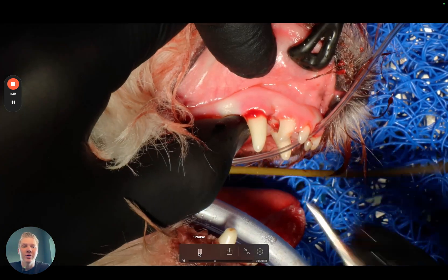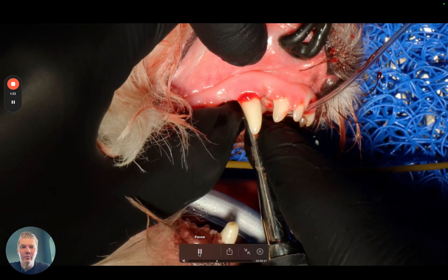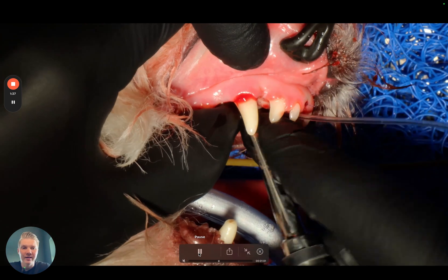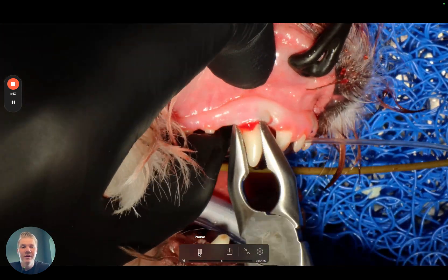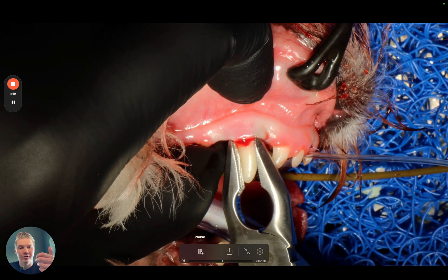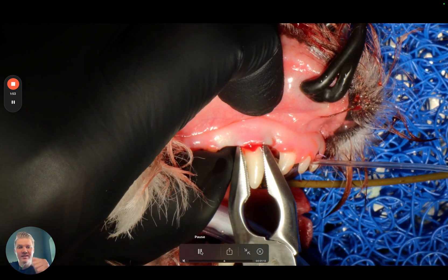Then I move on to an elevator or luxating elevator, winged elevator, whatever you prefer — something that you can twist without breaking it. So I am just giving it a little bit of final release before applying my extraction forceps. The trick here is to use an extraction forceps that fits the tooth very nicely so you can get a very good grip. And I pull and I twist at the same time.